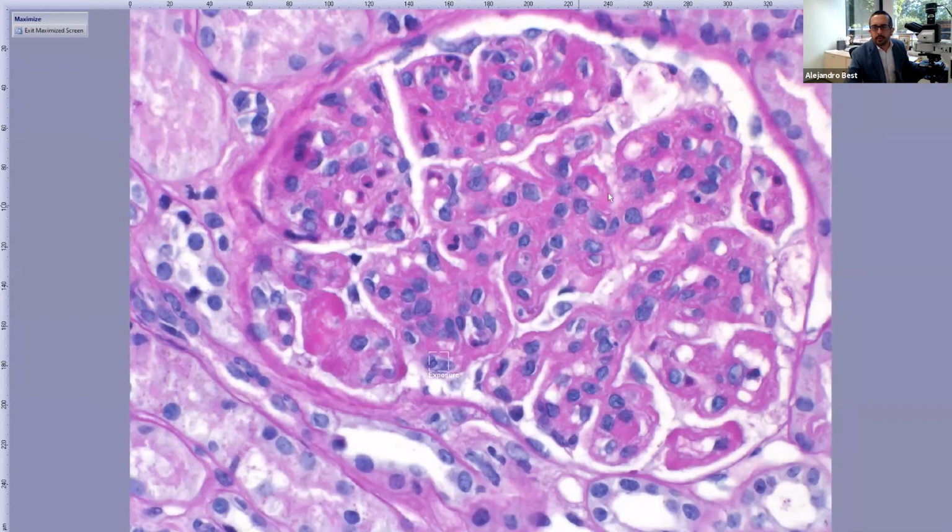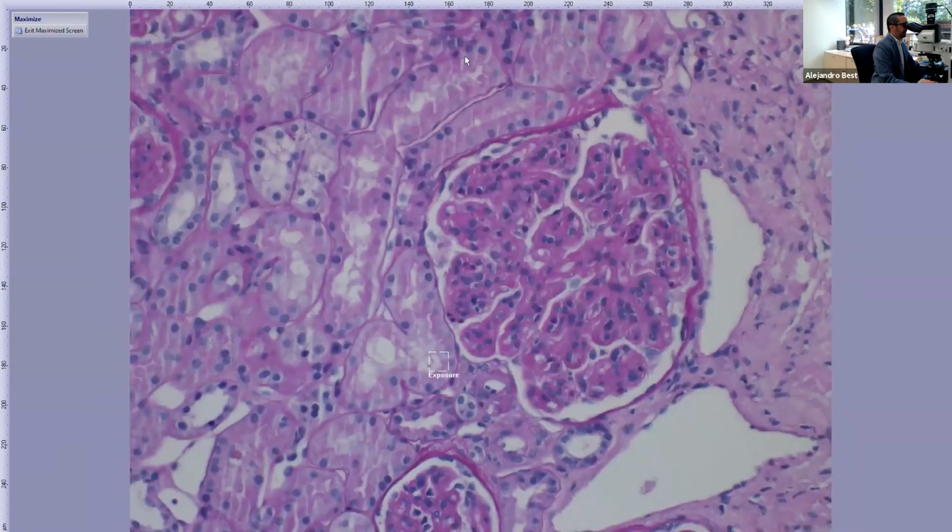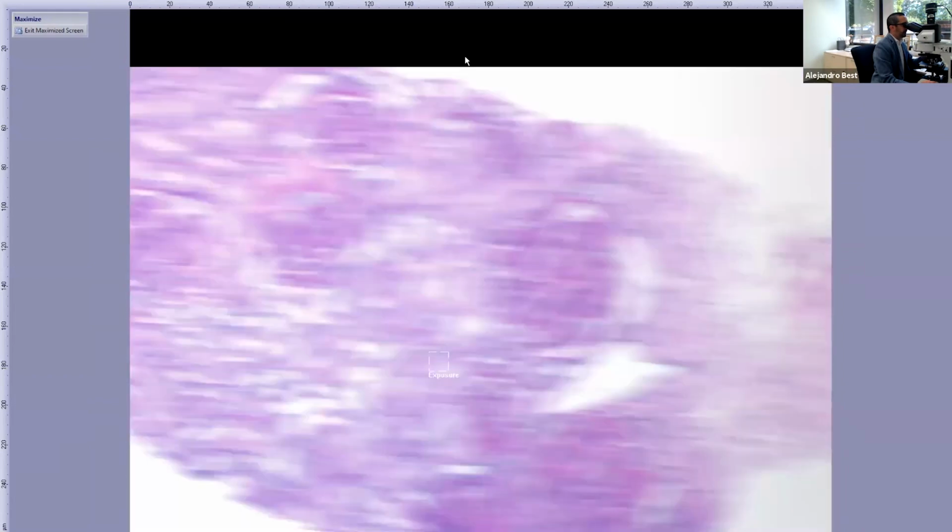Now, remember, we mentioned that most of the cells were mononuclear, with one reniform nucleus and abundant cytoplasm, but you have areas where we start seeing more segmented neutrophils here. All right, so very classic MPGN pattern of injury. Let's put on hold the glomeruli.